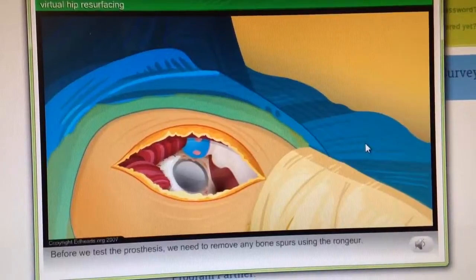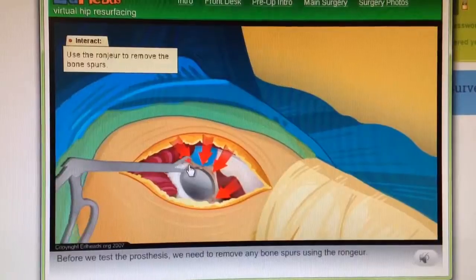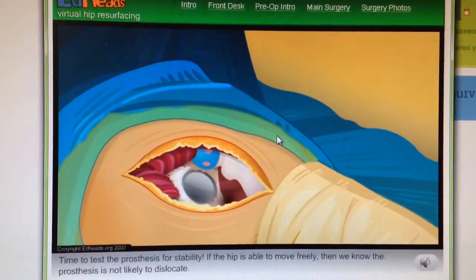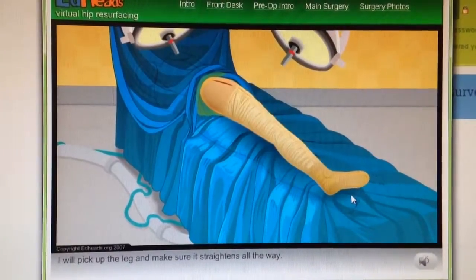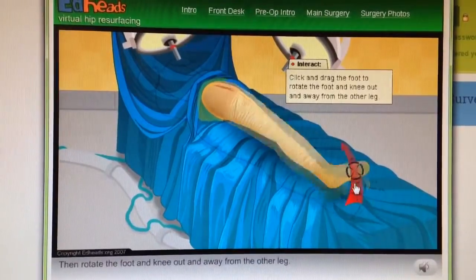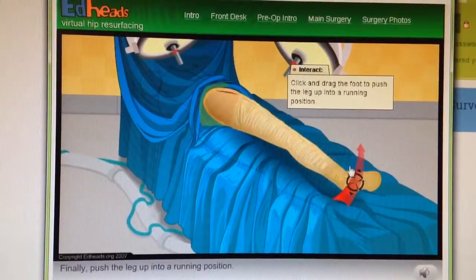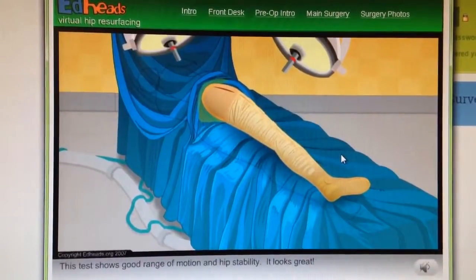Before we test the prosthesis, we need to remove any bone spurs using the rongeur. Time to test the prosthesis for stability. If the hip is able to move freely, then we know the prosthesis is not likely to dislocate. I will pick up the leg and make sure it straightens all the way, then rotate the foot and knee out and away from the other, then rotate the leg inward toward the other leg, and finally push the leg up into a running position. This test shows good range of motion and hip stability.